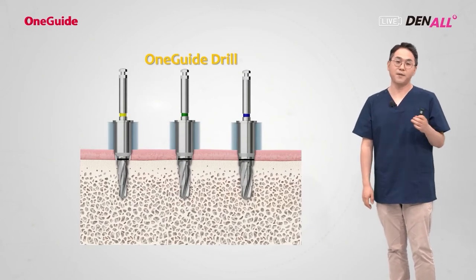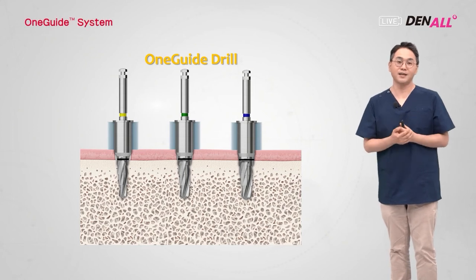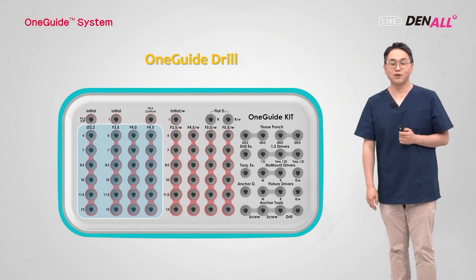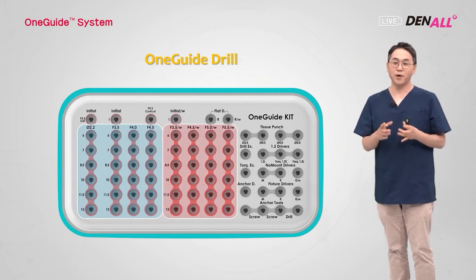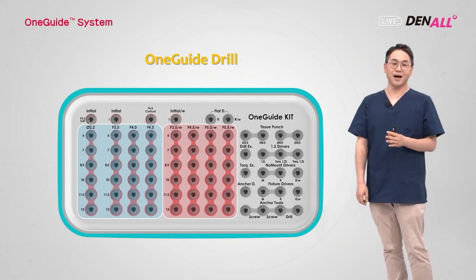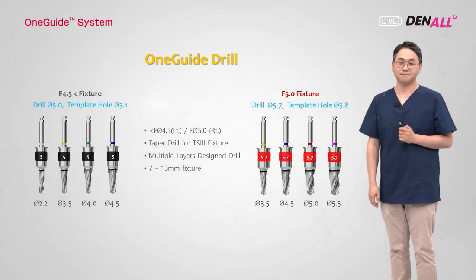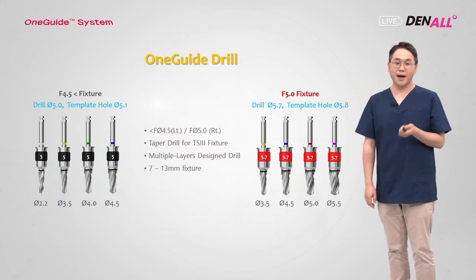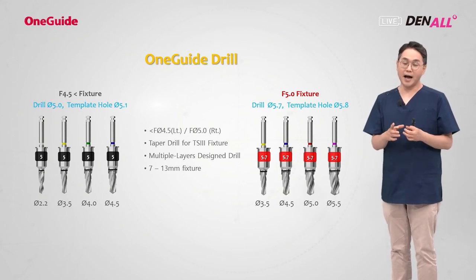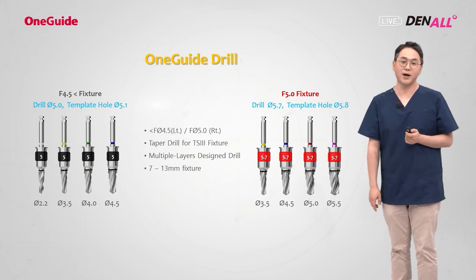After the initial drilling, the final drilling is done with the OneGuide drill. Most of the drills in the OneGuide kit are the OneGuide drills. The choice of the drills will be according to the size of the implant, that is 4.5 millimeters or smaller, or 5.0. The guide barrel sizes are 5.0 and 5.7. The tolerance between the guide barrel and the guide hole is 0.1 millimeters, maximizing the accuracy.